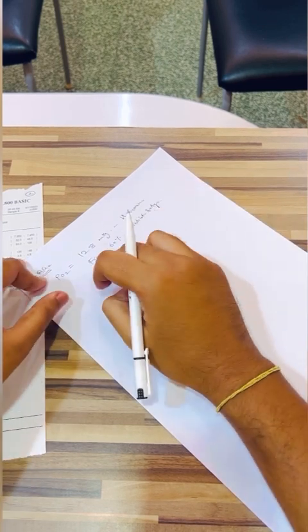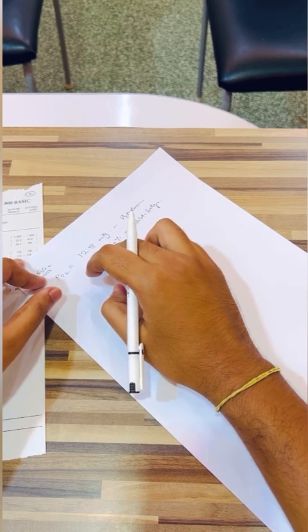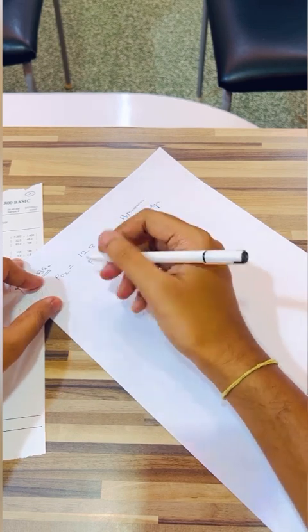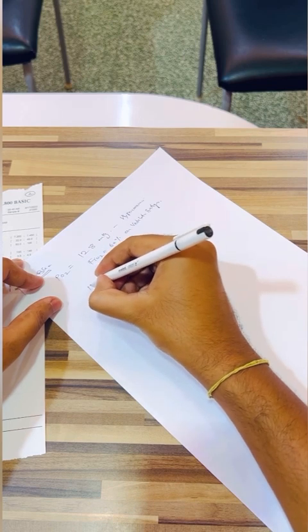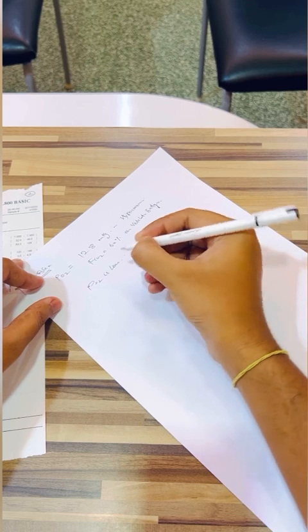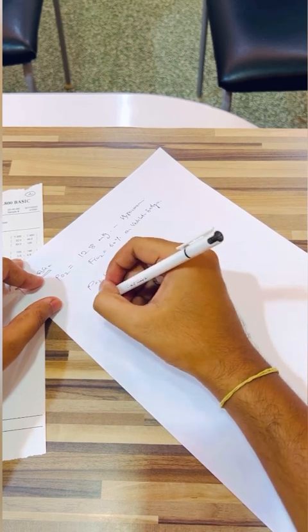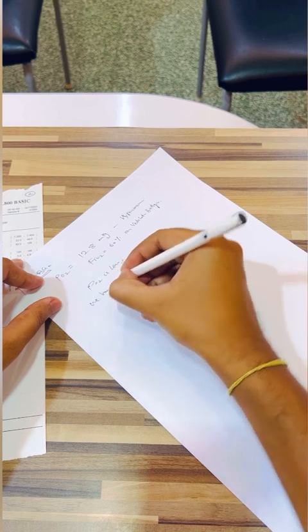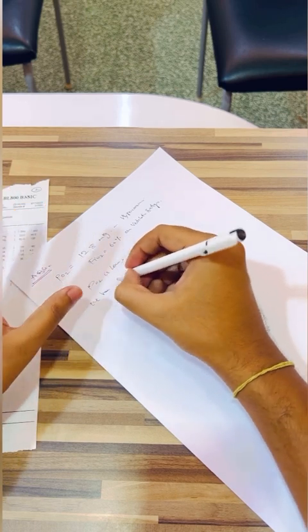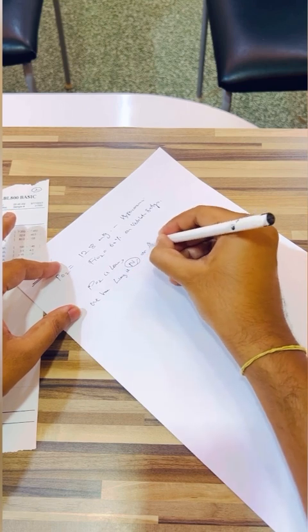See, this FiO2 is 60%, and the PO2 is 128, which is hyperoxemia. But the PO2 is actually low on this setting.